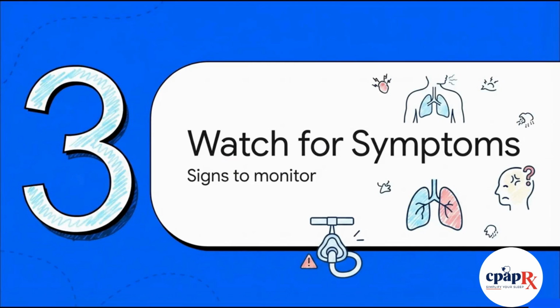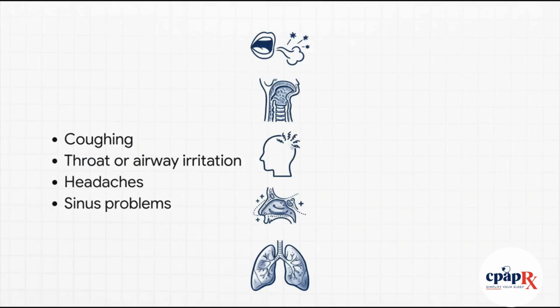Here are the specific physical signs you actually need to be watching out for. Based on official reports, folks exposed to this degrading foam have flagged a specific cluster of symptoms. We're talking unexplained coughing, throat or airway irritation, persistent headaches, sudden sinus problems, and in some cases much more serious respiratory issues. Now, whether these symptoms are connected to the foam really depends on your personal health history and how long you've been using the device.